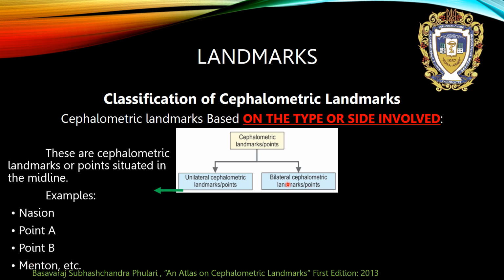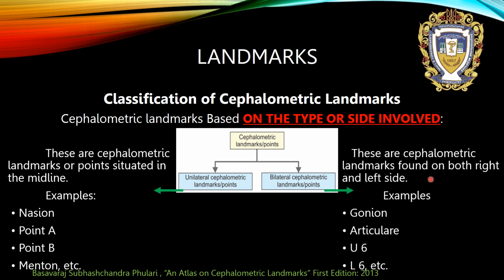But bilateral cephalometric landmarks or points are cephalometric landmarks found on both right and left side.